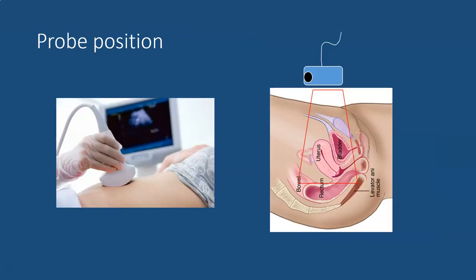The probe will be placed just above the pubic symphysis with the indicator towards the patient's head. On our screen we'll be able to see the underlying organs, with the most anterior being the bladder, followed by the uterus, the cul-de-sac, and perhaps the rectum.